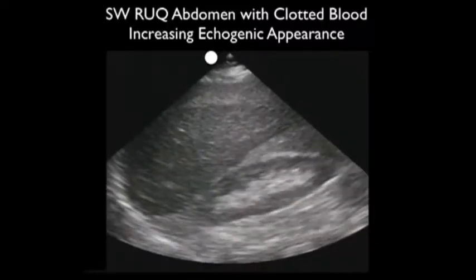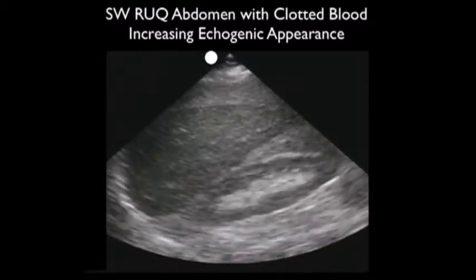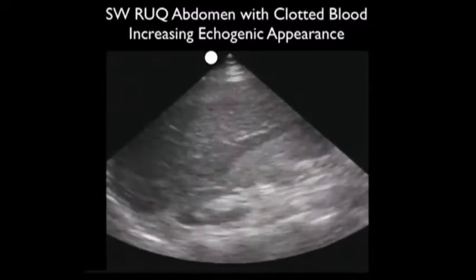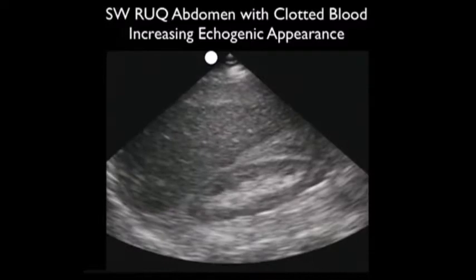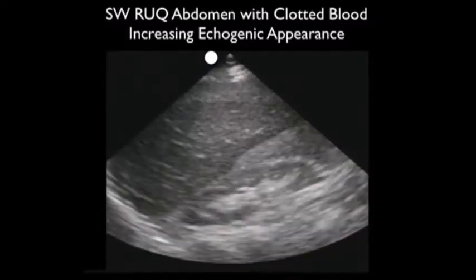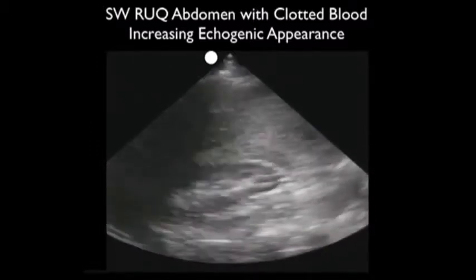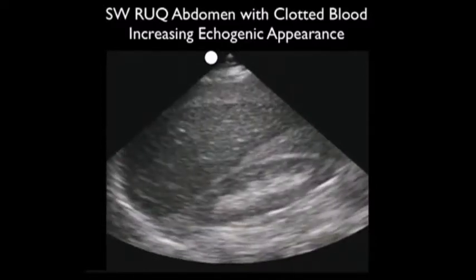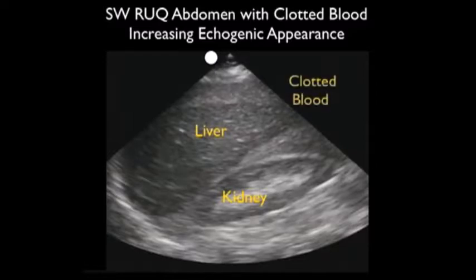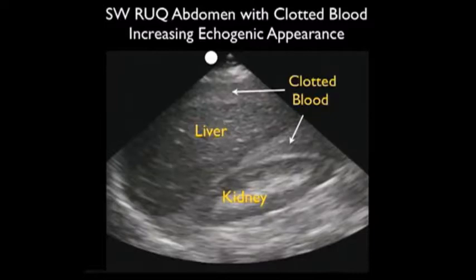In the last few video clips, fresh fluid appeared dark or anechoic. However, as blood clots, it can take on a more echogenic or lighter appearance. In this video clip, a patient was stabbed and had significant downtime before arriving at the emergency department. As we look at the hepatorenal interface, we see a large amount of clotted blood with that echogenic or lighter appearance. The large amount of blood extends into the right pericolic gutter as we scan inferiorly — we can see the liver, the kidney, and the clotted blood in Morrison's pouch.